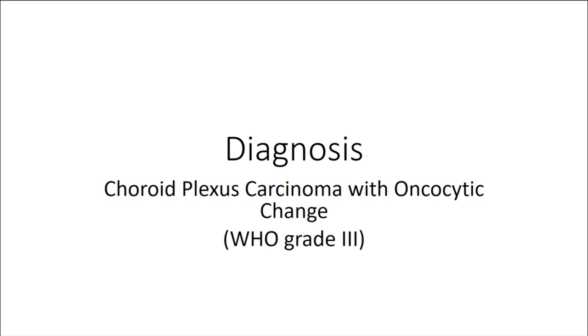Some of the early literature for choroid plexus carcinomas and ATRTs, there was some paper suggesting you can have some choroid plexus carcinomas with INI1 loss, and that is not really considered valid anymore. So if you have something that looks really epithelial and has INI1 loss, you are most likely dealing with an ATRT rather than a choroid plexus carcinoma. Almost by definition, choroid plexus carcinomas do not have INI1 loss to any significant extent.